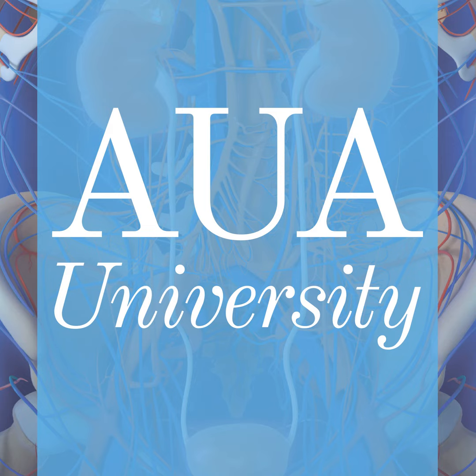The prostate salvage therapy guidelines were just reported at this meeting a couple days ago. I will just reiterate that PSMA PET is now completely acceptable according to guidelines in lieu of our conventional imaging or after negative conventional imaging. And there is a fairly strong statement that PET should be performed prior to salvage radiation therapy, which is now the gold standard in terms of postoperative radiation therapy compared to adjuvant therapy.